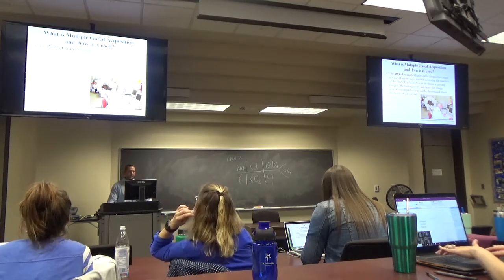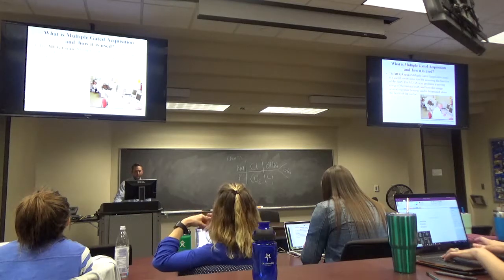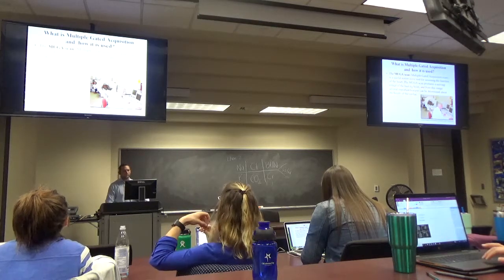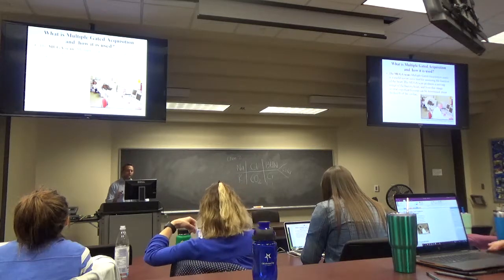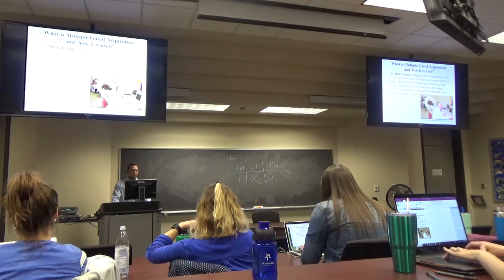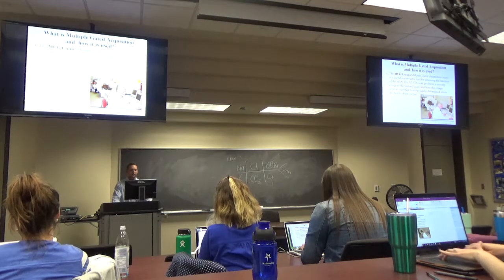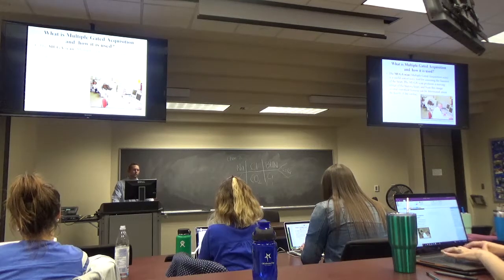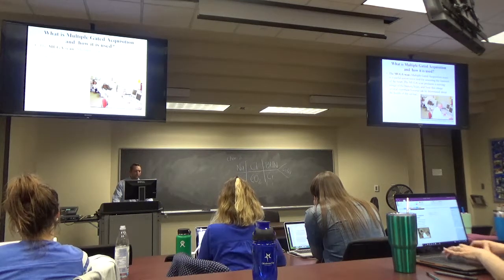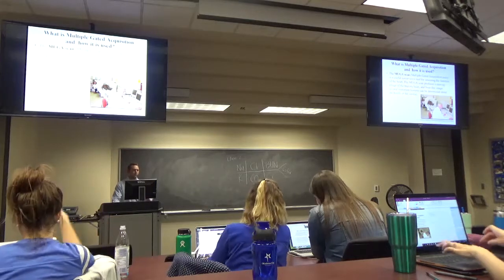So this is a test that was being heavily used, I would say about 20, 30 years ago. It's the multiple gated acquisition scan, and it can give you a really precise ejection fraction. The reason it's not being used as often now is the availability of echo. Echocardiograms are available at bedside. You don't have to put the patient into the scanner and do a nuclear test. You can just do everything at bedside. So now this is not happening very often anymore. It does happen, though, for people with cancer, and we'll get into that.